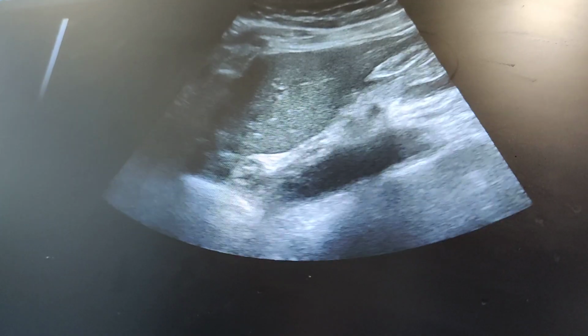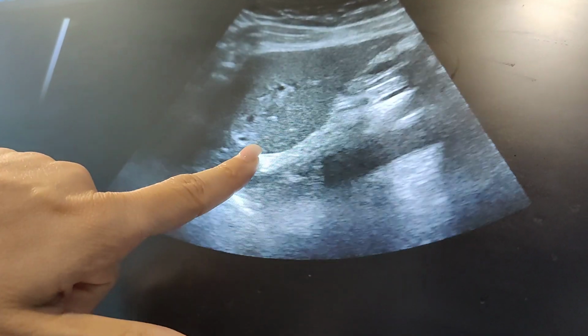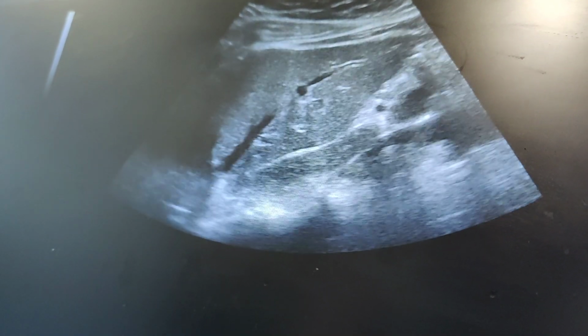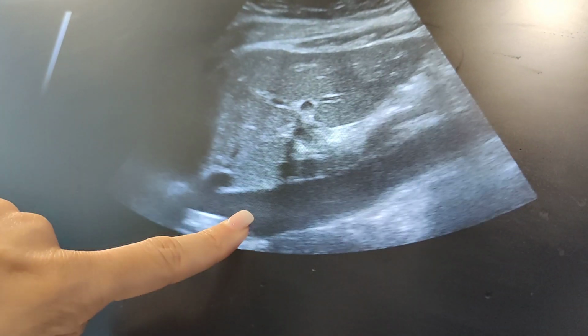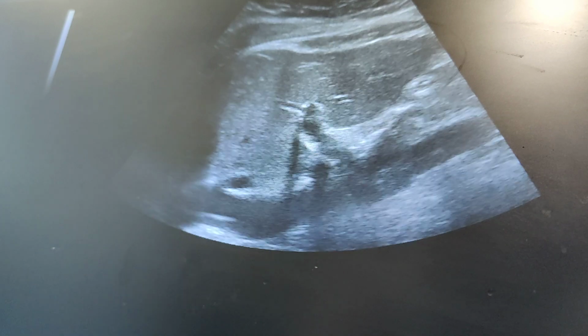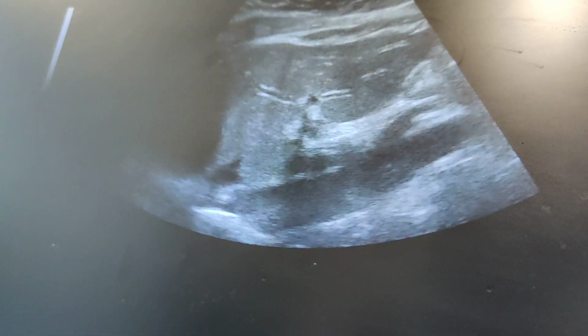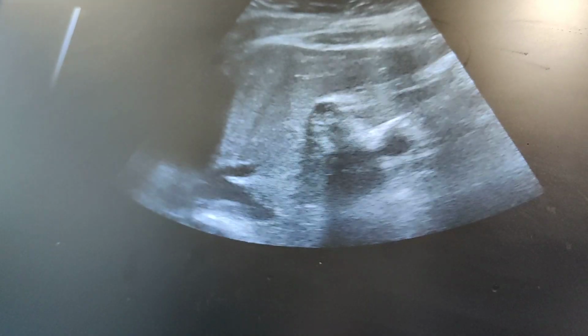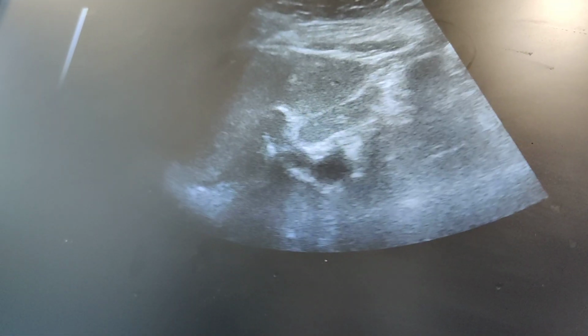Landmarks we're looking at with the left lobe, we see the aorta. Keep coming over, you see the caudate lobe, and then the IVC, or inferior vena cava. If I've swept through all of those, I know I've covered in long axis the left lobe segment. So you can decrease your depth.